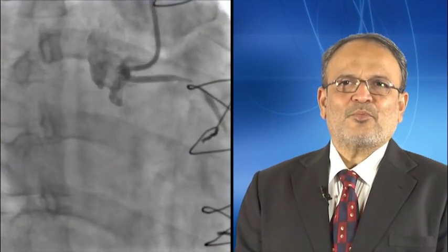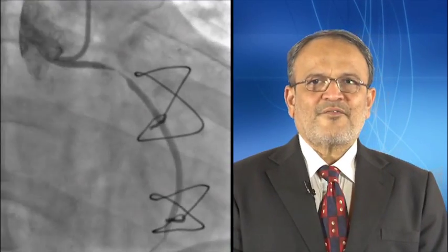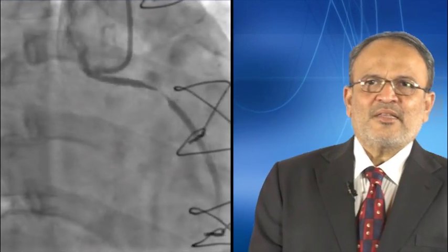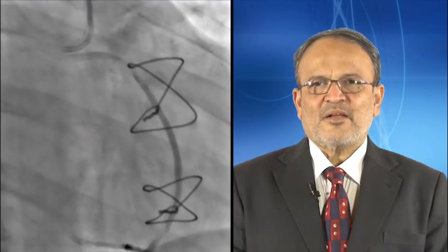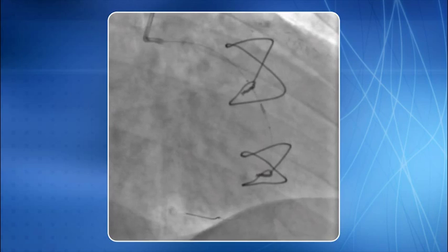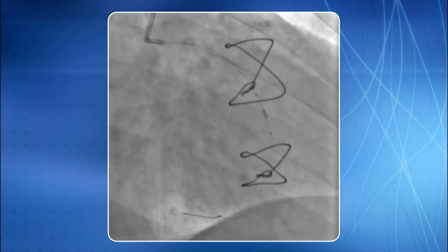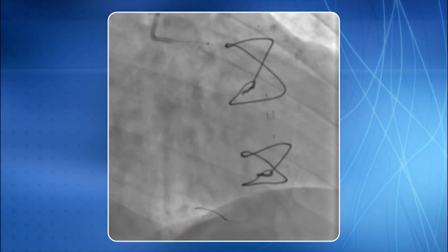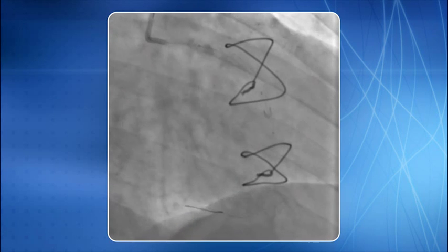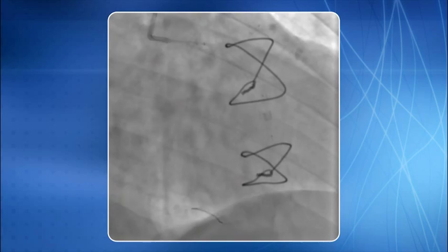This is an interesting case of two very tight lesions in the saphenous vein graft to PDA. The first lesion is in the proximal part and the second is in the distal segment. A 6F AR1 guide catheter was seated coaxially in the graft. Interestingly, the distal protection device was deployed in the middle part of the graft, equidistant from both lesions, because we were not able to negotiate the device distal to the second lesion.